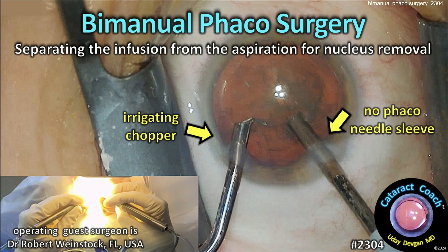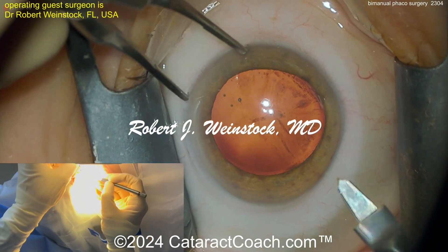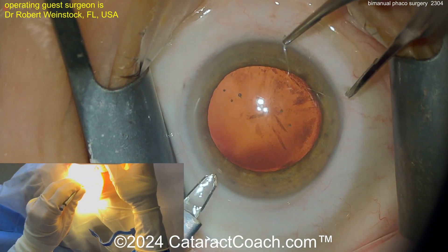Cataractcoach.com bimanual phaco surgery — separating the infusion from the aspiration for nucleus removal. You've already used bimanual IA, and this is bimanual phaco. Same concept: one hand has irrigation and one hand has aspiration.